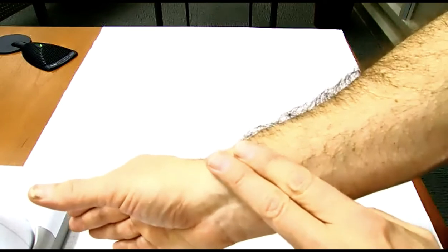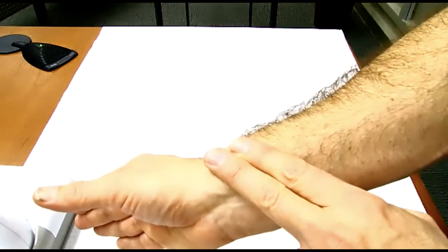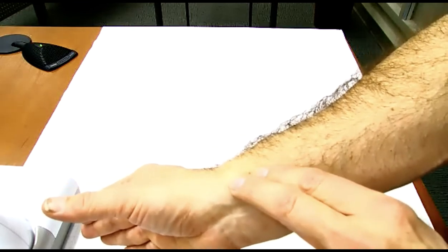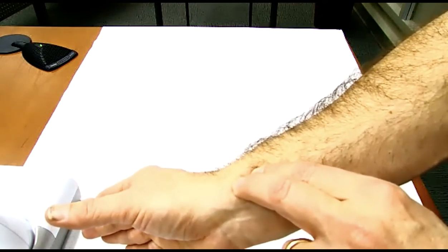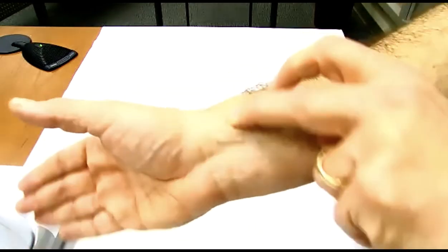And again, some people I will see will be able to just lay their fingers across, and some people are much more sensitive. If you can feel it that way, that's great. Like I said, maybe I've got issues, but I usually have to take my fingers and angle them a little bit and push in. You don't have to push in hard, but you need to depress firm enough to be able to feel the pulse. So right now in my middle finger, I can definitely feel my pulse. And notice where I am on the hand.